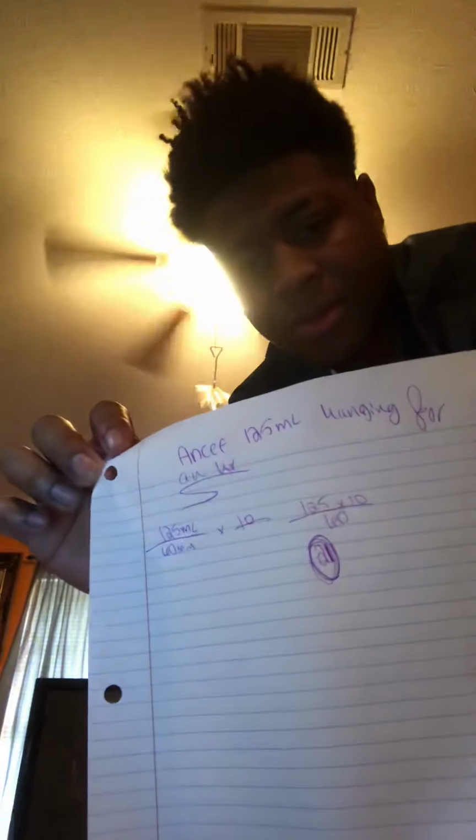And let me just do this calculation real quick. 125 times 10 divided by 60 is 20.8. But you want to round that and make it 21. So it'll be giving it 21 drops per minute. If you can see that.